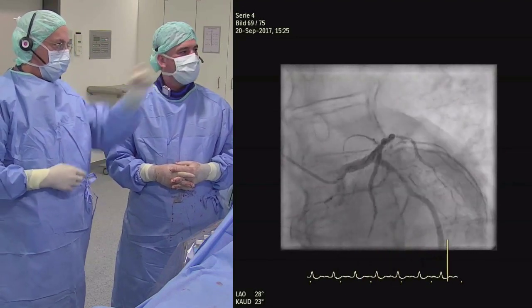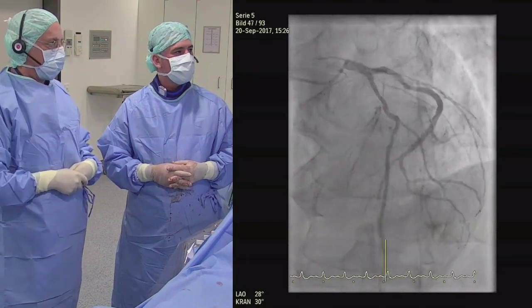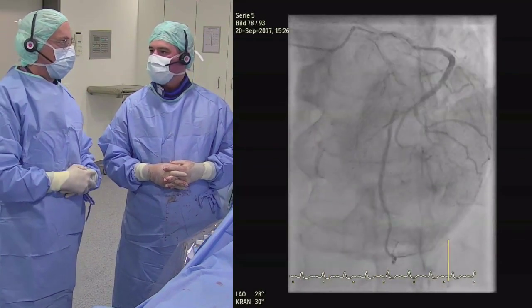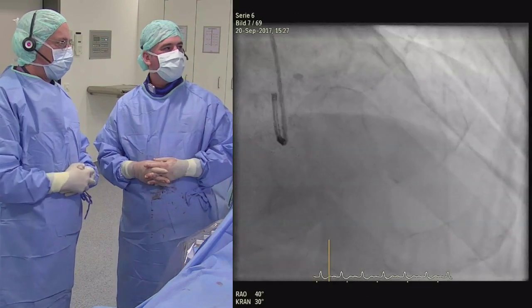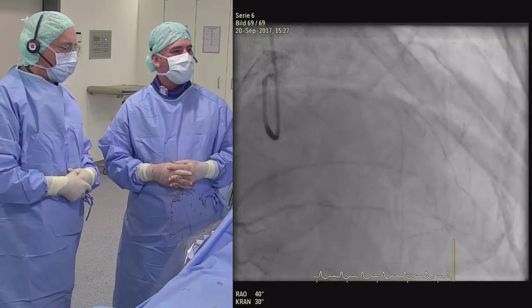Just as the left coronaries are going by, you could see those small, diffusely diseased diagonals that may contribute to part of the ischemia. True. But those branches really look very small. So I have a question. What does the panel think?